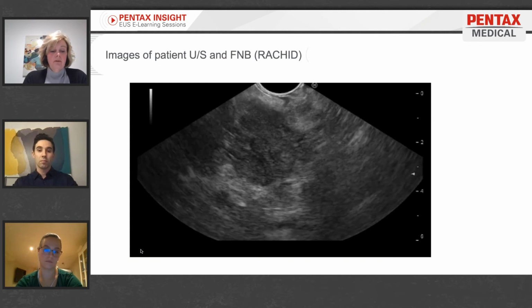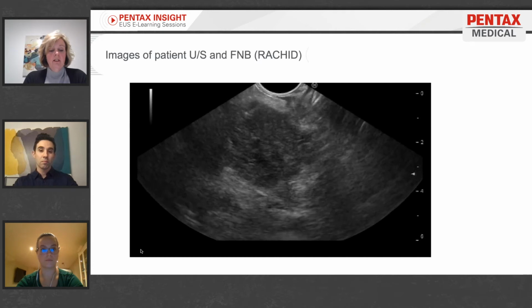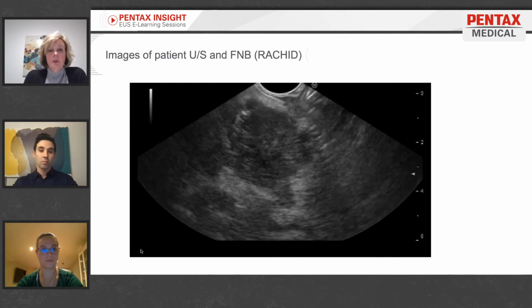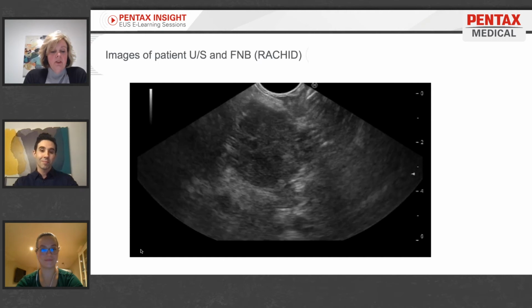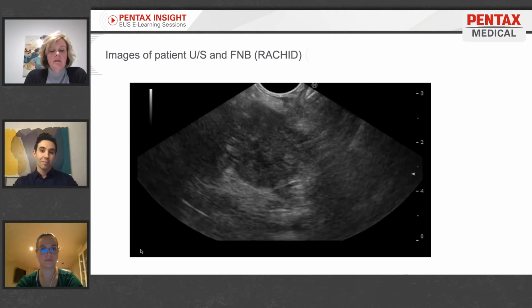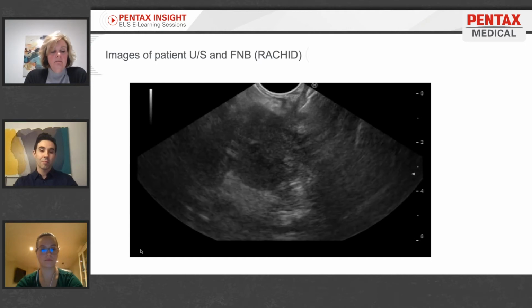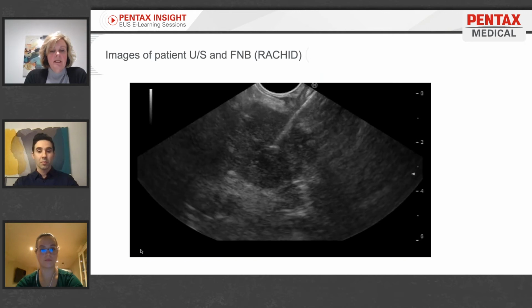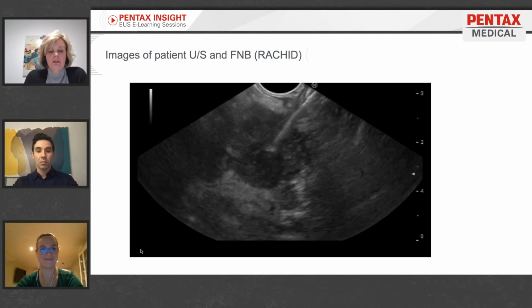I'm just going to review a few steps involved in tissue acquisition and retrieval. There are multiple steps, so I hope I don't lose you along the way. When the physician is ready to obtain the specimen, the biopsy cap is removed from the working channel of the scope and the needle is inserted down the working channel. Most EUS needles have 2 settings. We're just doing the biopsy right now as on the video.